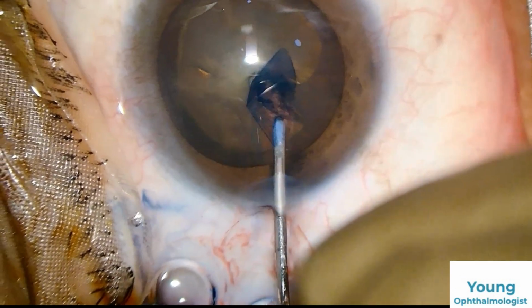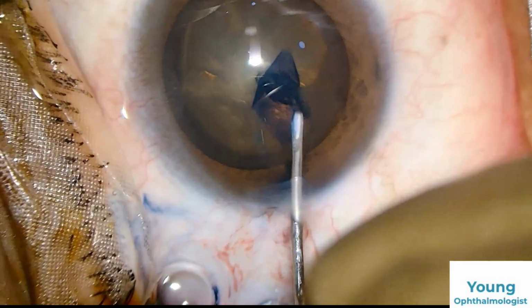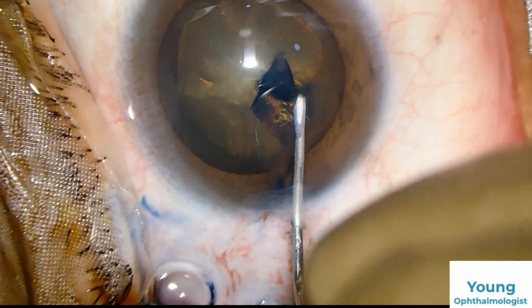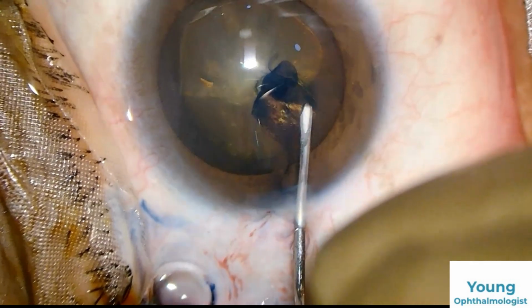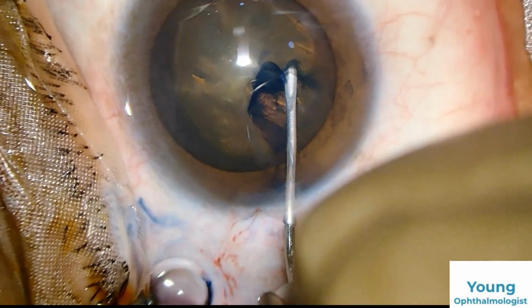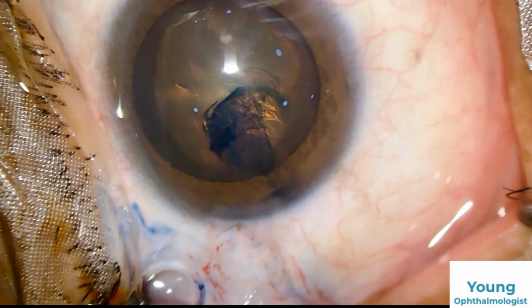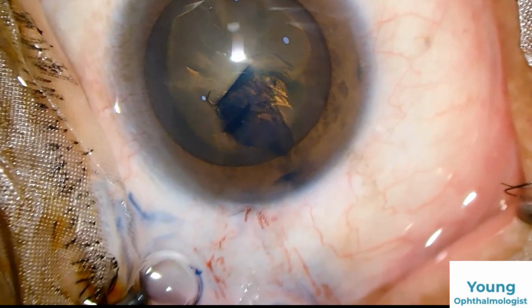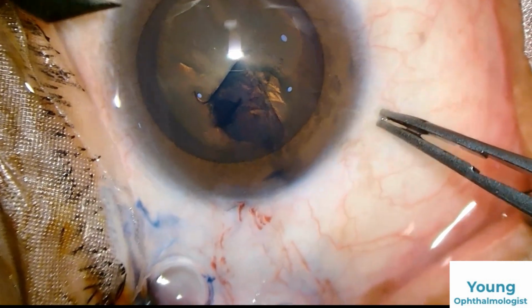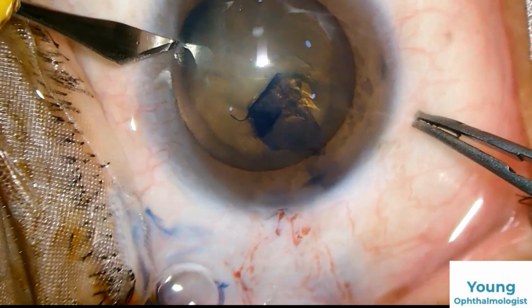Here we have reached the capsulorhexis. Here the patient should be informed that we are doing a very important step. They should not move their eyes. Once you have done the capsulorhexis, further steps are easy because you have one phaco probe and one dialer or chopper stabilizing the eye.